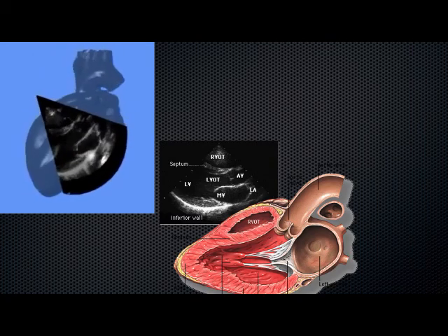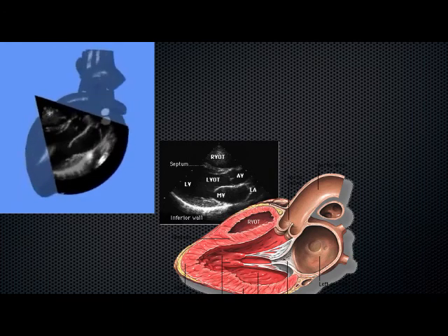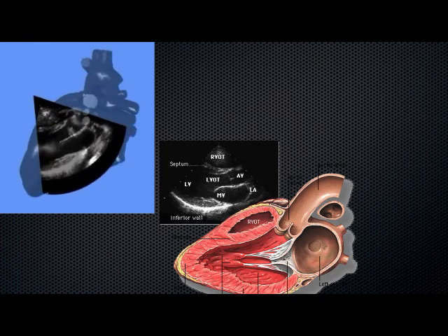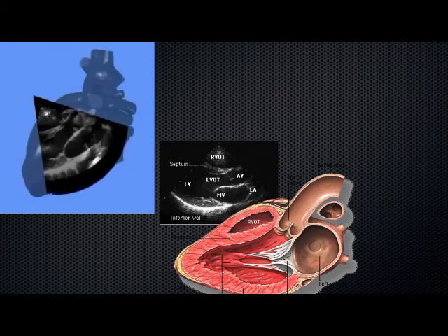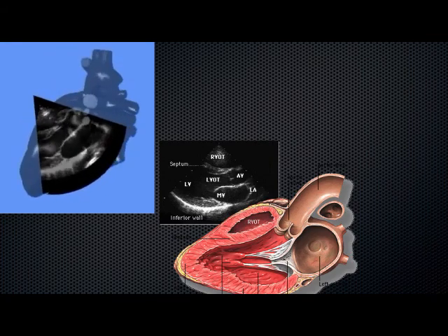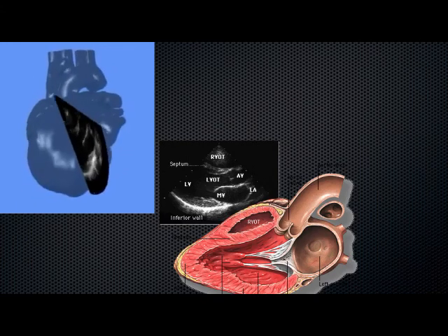And when that's the case, what you see on the screen is right there in the middle, you have kind of an anatomic representation of what you're seeing. The top part of that view is the right ventricle, then the next part is the septum, and then the next part is the left ventricle, and then aortic outflow tract. And hopefully we'll get some examples when we have you guys in our practical session.